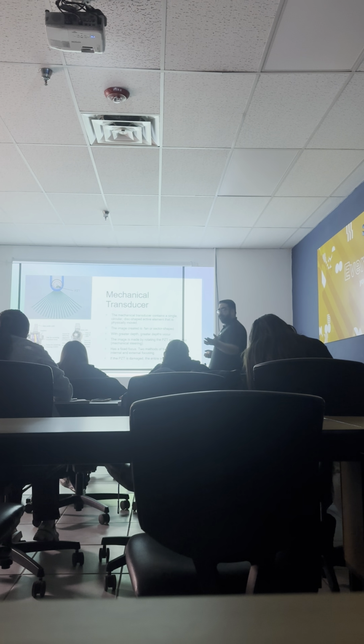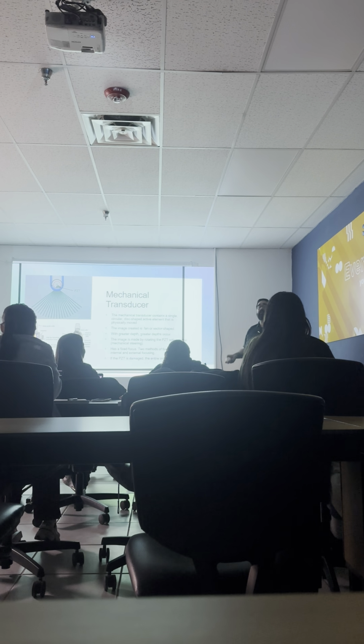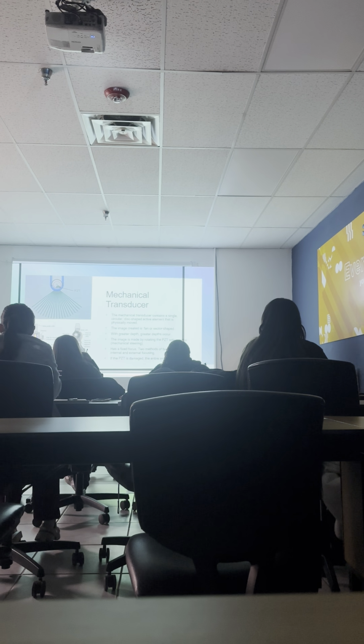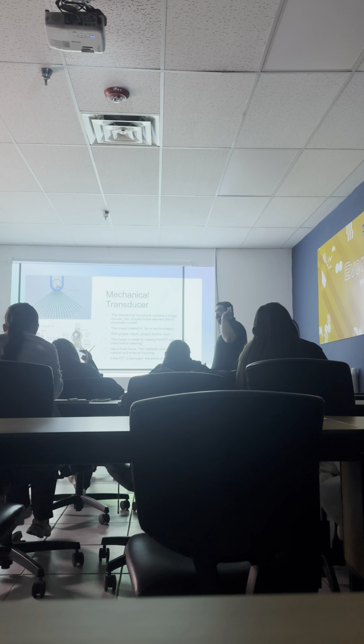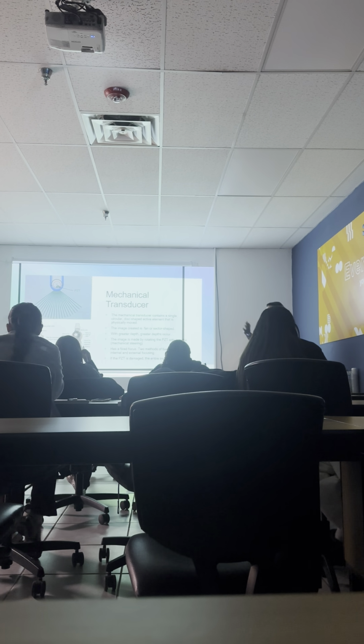Okay, so movement, right? What do we want to move in our ultrasound images? What needs to move? Like inside the crystal? Okay, yes, the crystal. Is the crystal physically going to move with a mechanical transducer? Yes, it does. Okay, so why do we want our crystals to move? It distorts and creates a vibration. Okay, so we want the piezoelectric effect for sure, right? But we're talking about the movement of the crystal itself.